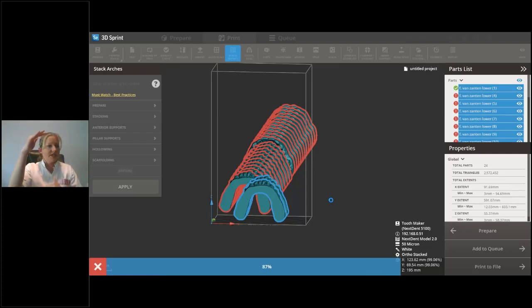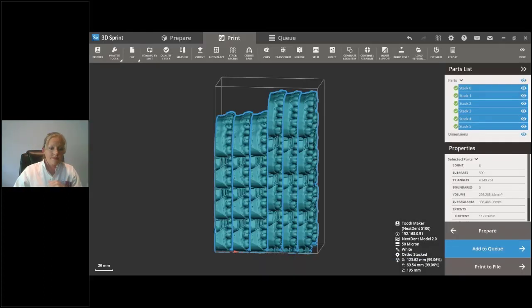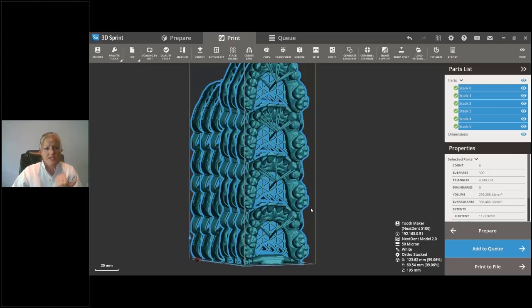So we're able to print almost 8 inches high in this axis. And we have stabilizer support, so it will be just as accurate on the very top in any area as it is at the bottom. And there are some actual settings you can change too.